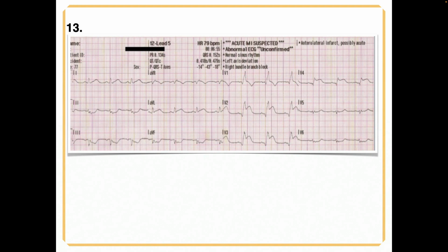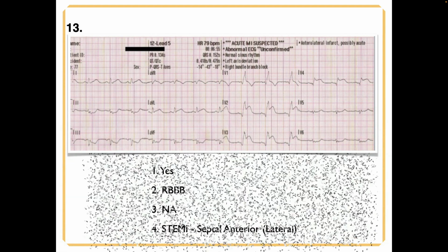Correct. And the reason I left the printout in, I won't do this on the test, by the way, is there is this absolute pervasive belief out in the paramedic community that you cannot tell a STEMI in a right bundle branch block. And it's just wrong. There's no two ways about it, it's wrong. And so first of all, you can see it, and then I said, okay, I like the printout when it agrees with me, so I'm going to put it in. So, okay, we're almost done. A few more things in this lecture, and then we'll take a break.